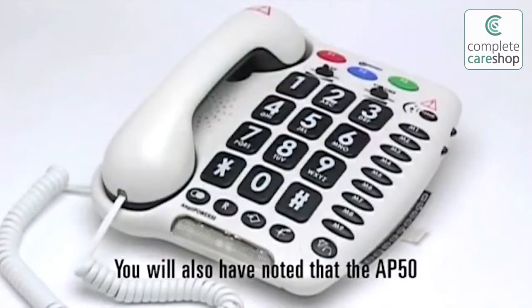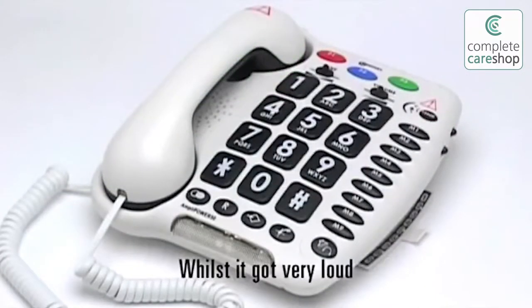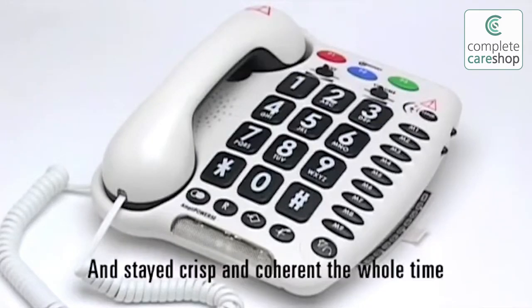You will also have noted that the AP50, whilst it got very loud, the sound did not distort and stayed crisp and coherent the whole time.